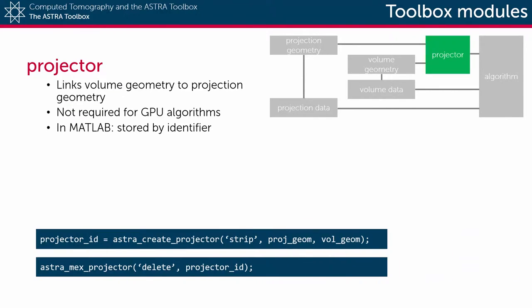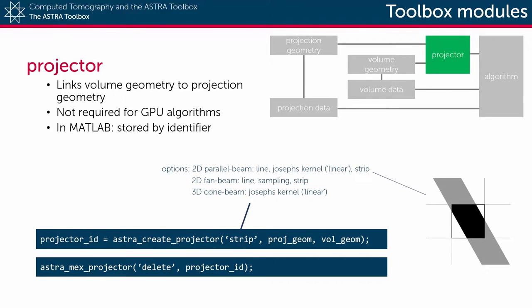To configure a projector, use the function astra_create_projector. As arguments, put the type of projector you wish to use and its corresponding projection and volume geometries. Depending on the type of projection geometry, multiple projector types are available.